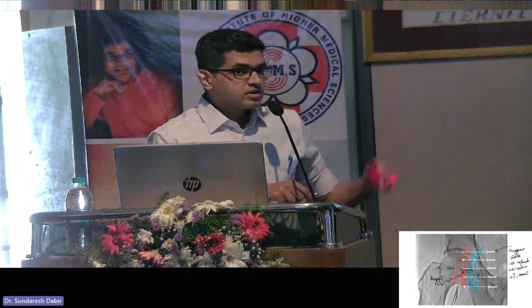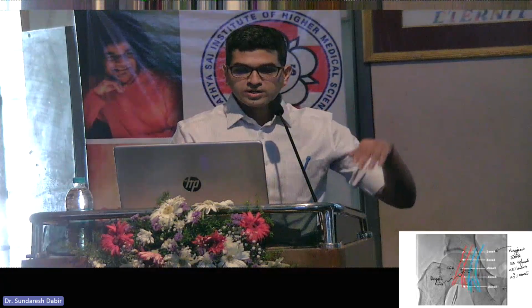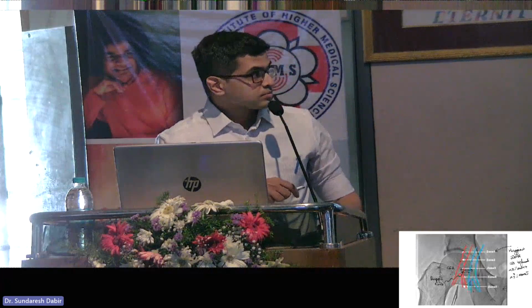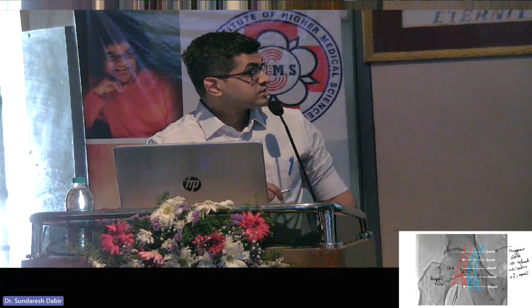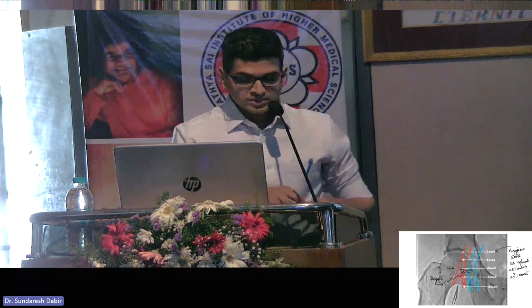Okay, so my needle on the skin will be here, and when I take a 45-degree angle and go in, it will puncture here. So we have to always try to puncture here. Okay, this is Rupp's point or Rupp's rule: the medial most aspect of the head of the femur, you go 1 centimeter lateral to that, and that is the ideal point for femoral puncture.